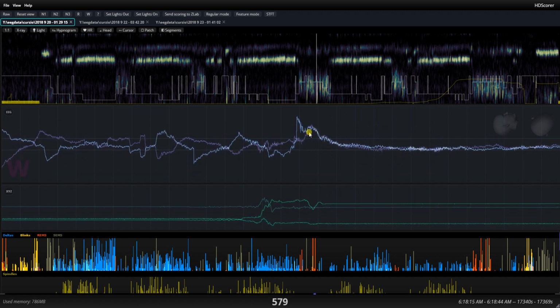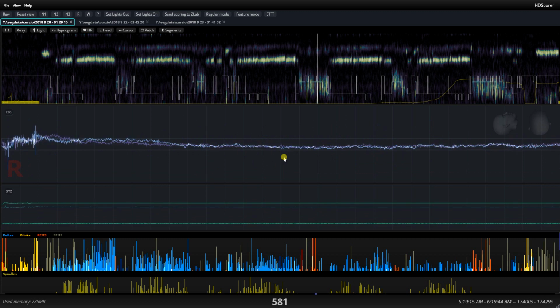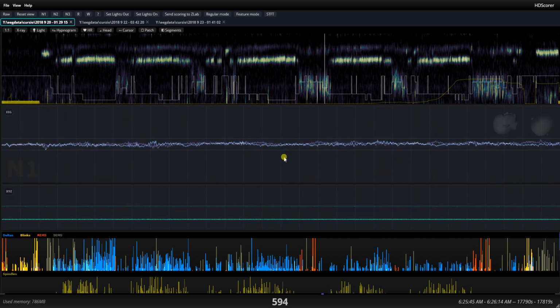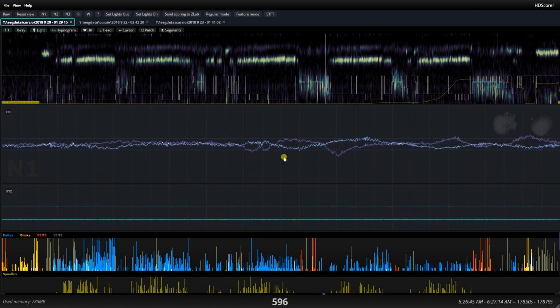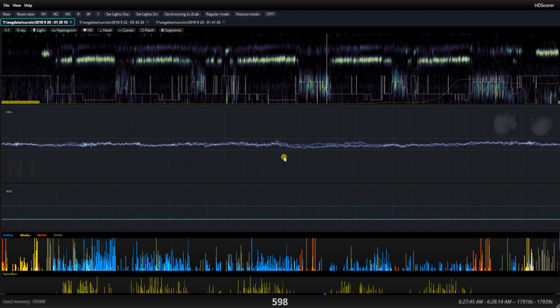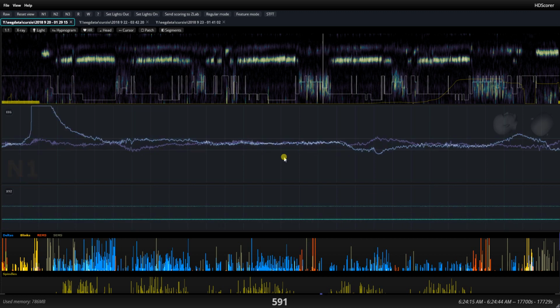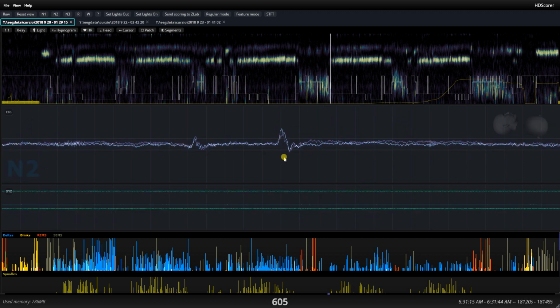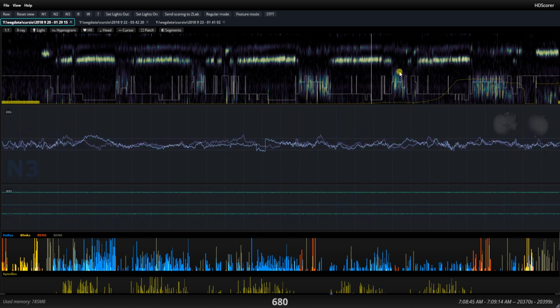As for this, well, we start with REM, but then there's a huge body movement, so for now I'm calling that wake, so that's all fine. Moving into here, we have N1 sleep. Slow rolling eye movements, yes, accurate, perfect. There is a chance that some scorers might still call this REM. Honestly, I don't know. Then there's wake, and then we begin again with the sleep cycle. Let's see if there are any other important features that I want to take a look at.